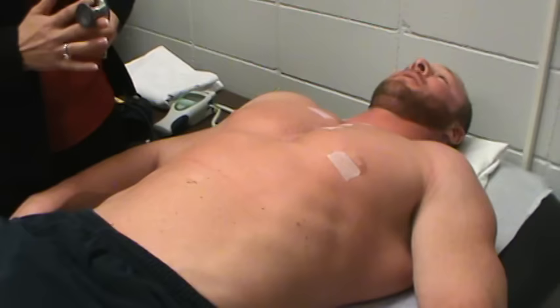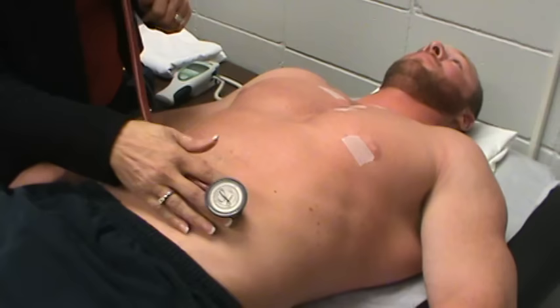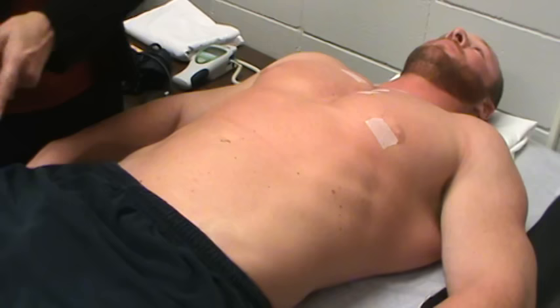Okay, now I'm going to listen to your abdominal arteries. Okay. First one that I'm going to listen to is your aortic, and I'm going to do that with my bell. Okay. I'm going to listen to your renal. All I hear is bowel sounds. I'm going to listen to your iliac. Okay. And then you do have femoral as well, but we're not going to listen to those today.